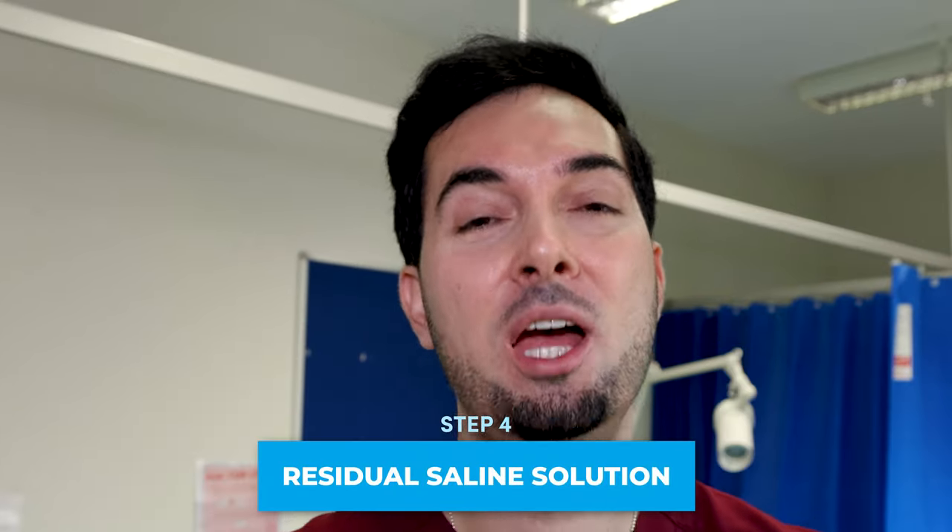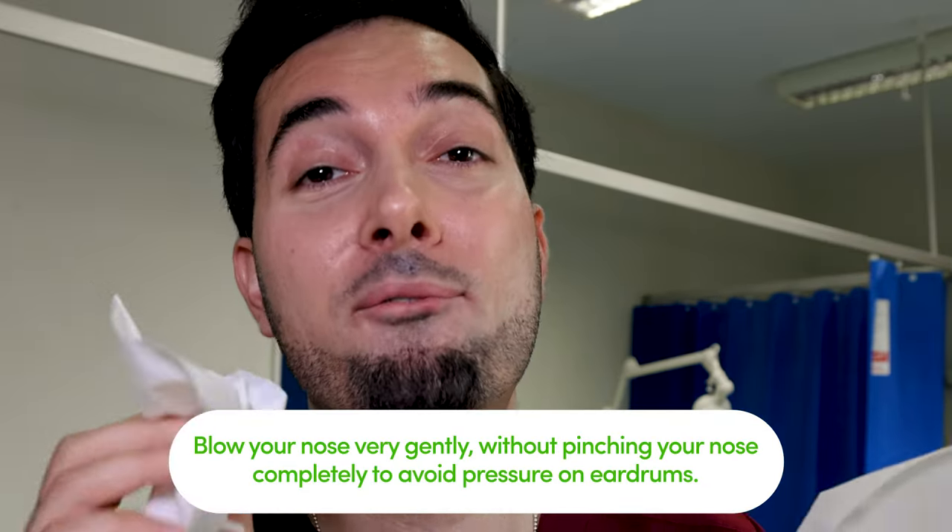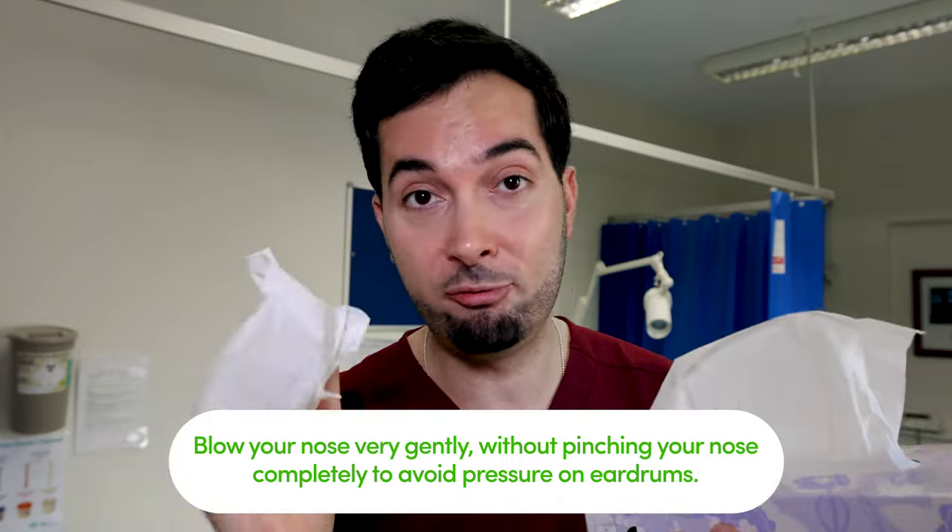Step four: right nostril is now done. Before moving to the left nostril, you'll have some residual solution in your nasal passage — this is completely normal. You have two options: option one, take a little tissue and with a very light grip, blow very softly — do not blow forcefully or you'll hurt your ears. Option two, gently sniff upward to move the residual solution to the back of your throat and spit it out.